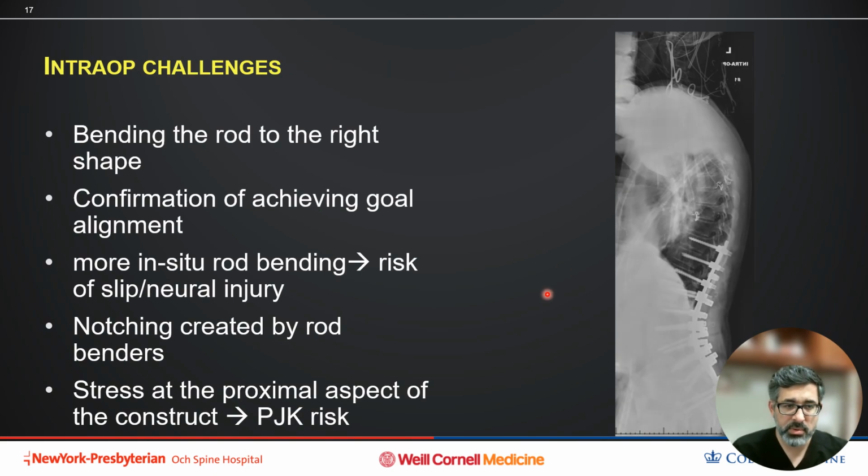And so, again, a few years ago, what I was doing was doing all this manually during the surgery myself. We had an idea of what the target should be. We bend the rod to that shape that we think the patient should have, and then you get x-rays intraop to see if you achieved the goal or not. But you didn't really have a good idea of how close you were to that goal.